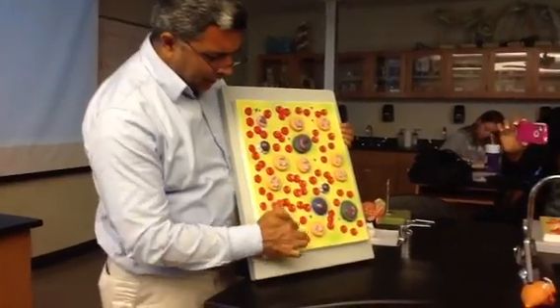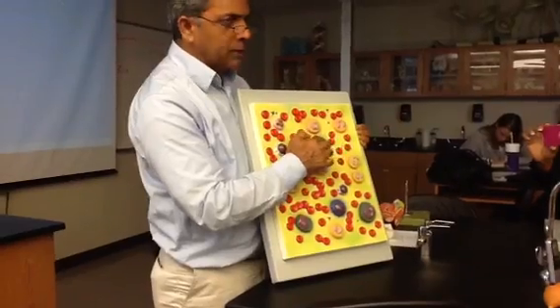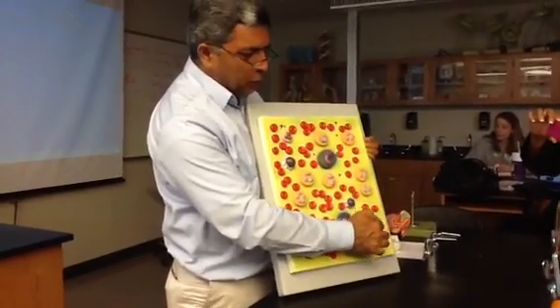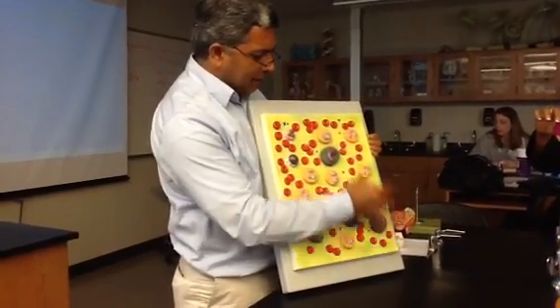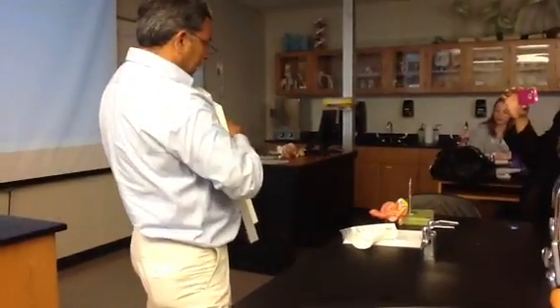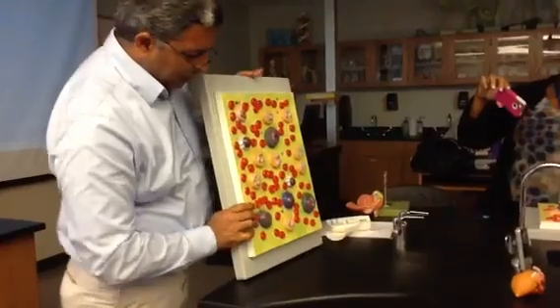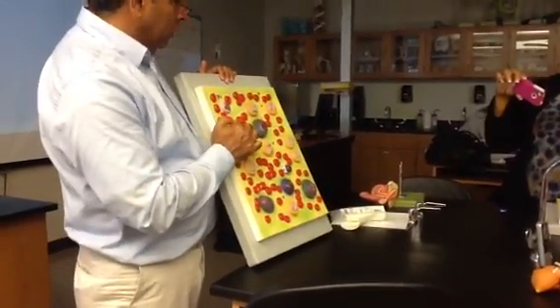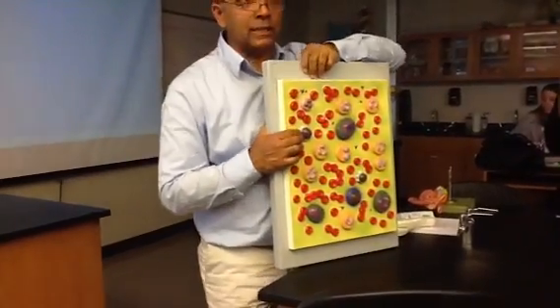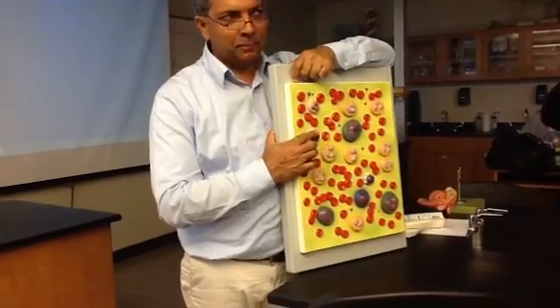Now the largest white blood cell in the bloodstream is the monocyte. Its nucleus is usually horseshoe shaped. This is the largest in size. The monocyte. Okay? So this is the monocyte, largest one. And then, ladies and gentlemen, a cell whose nucleus is almost completely filling the cell and only leaving a small cytoplasm in the periphery is a lymphocyte.